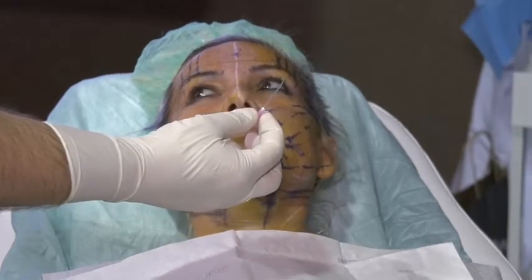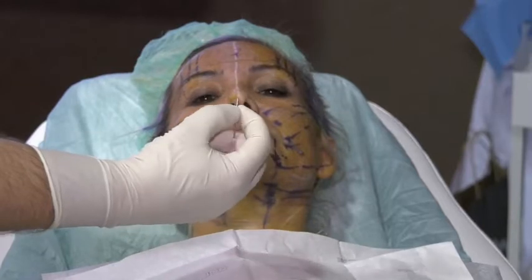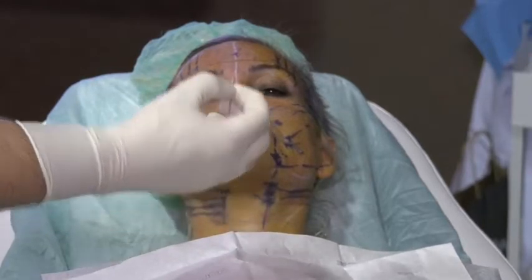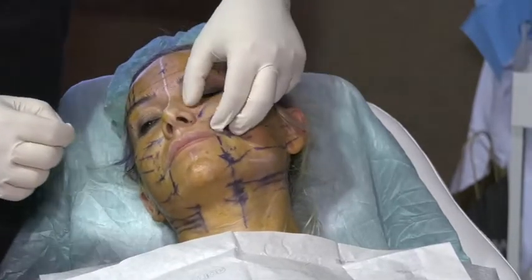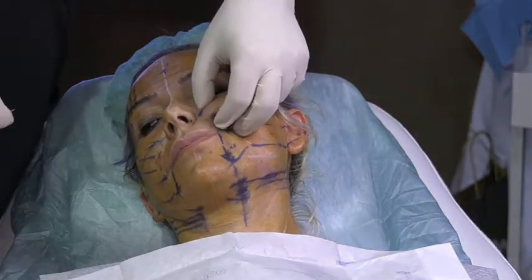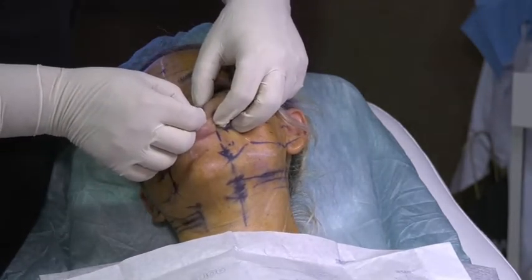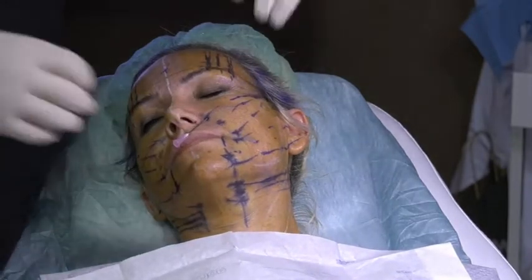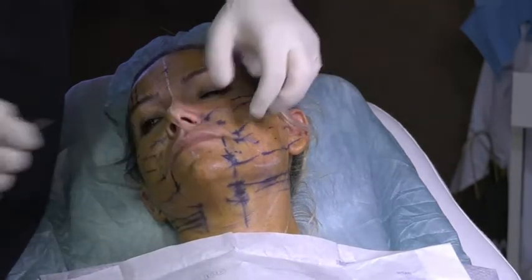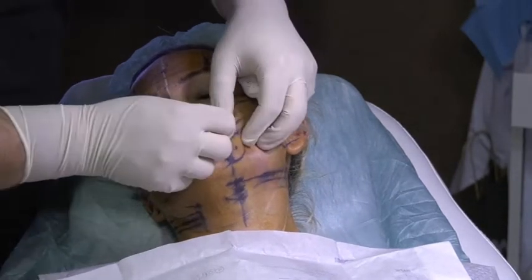But the issue is, please never hold the needle like that. The needle has to be held like that from the distal end, so you never go deep. I need only a very, very little drop. Always hold the skin between your two fingers at the same area of entry. Make a little drop with a 30G at an angle. Just a little, look, only this. I don't want the needle to go in, only the beveled part. And then you go out. Again, same story.